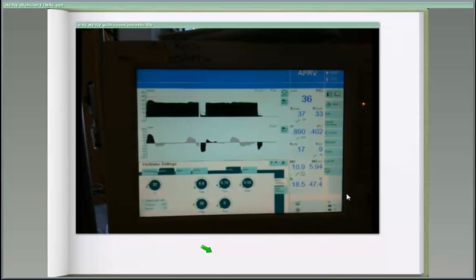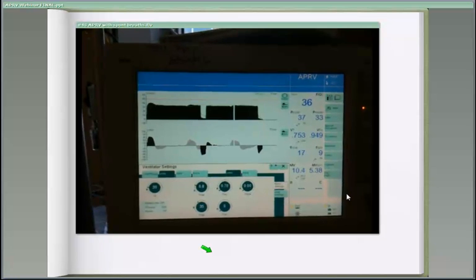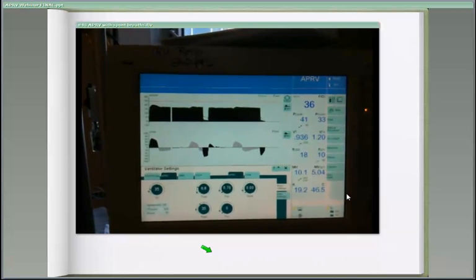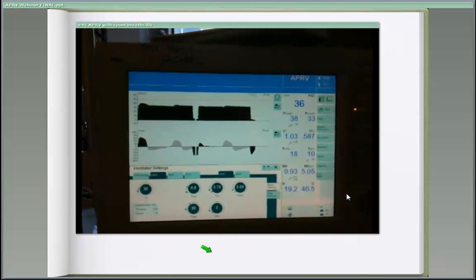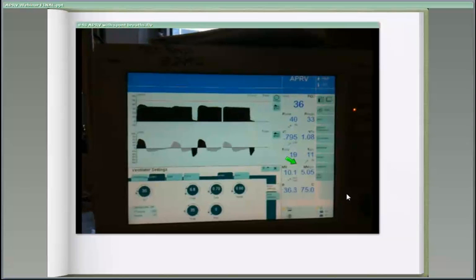You can see that the airway profile barely changes. There's no massive sucking down of the airway pressure that you would see as you develop a lot of transpulmonary pressure. And the patient is actually doing 50% of their minute ventilation. And this is typically what we do with patients. We almost never want to abandon spontaneous breathing. We let these patients breathe.